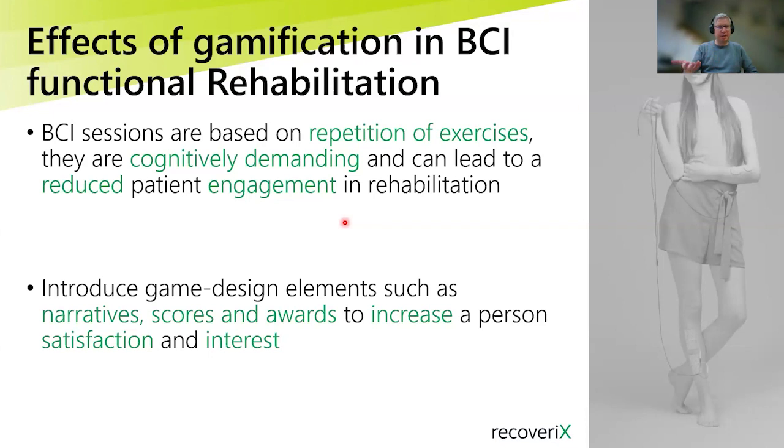You need this high number of repetitions, but if you always see an avatar just moving the hands or some other kind of feedback, it can be a little bit boring after 25 sessions or however many sessions you're doing. That's why we also introduce game elements, narratives, scores and awards to keep the motivation higher, to increase the satisfaction and the interest of the patients, and keep the compliance on a very high level.